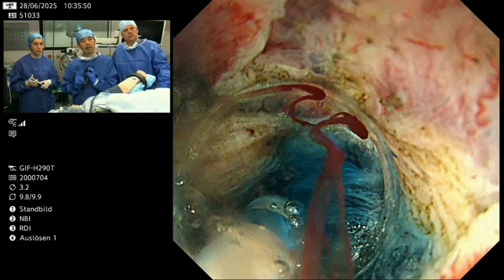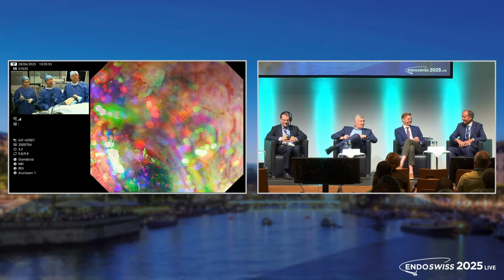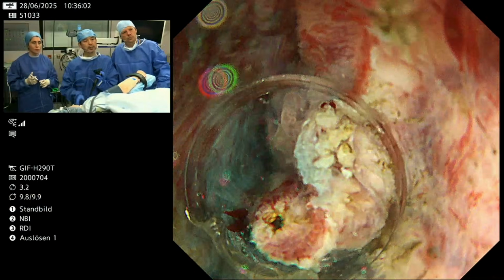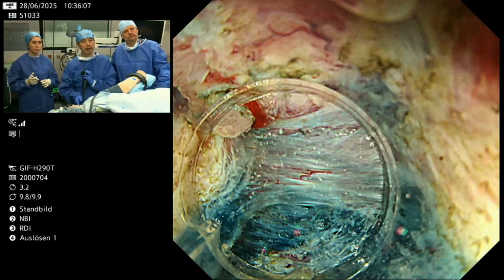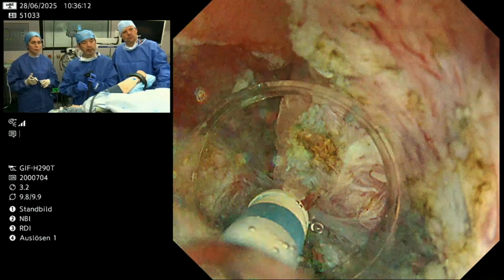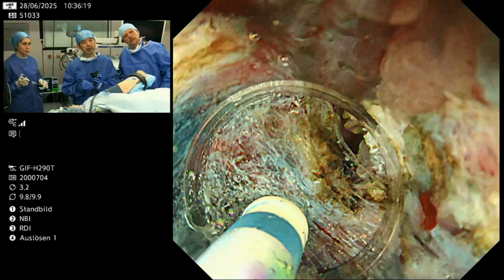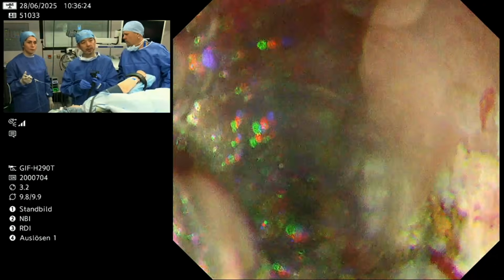Okay, I think we all agree that this is something like, kids don't do this at home. Okay, I have to cut here and open the submucosal space. Now I cleared the most fibrotic area. Luckily, there was no thick blood vessel, therefore I can speed up dissection for the rest of the submucosal tissue. Still, there are some blood vessels here, but by using precise sec, I can minimize the bleeding occasion.